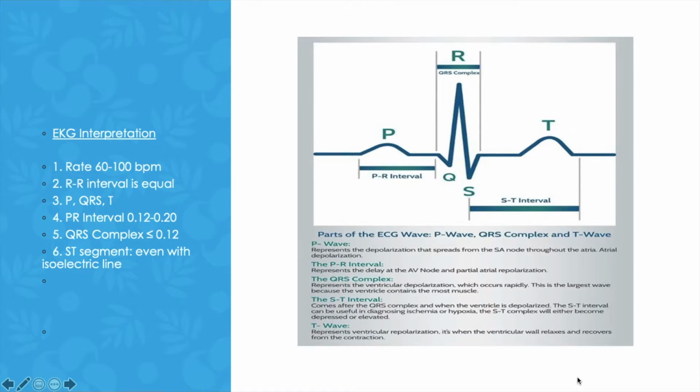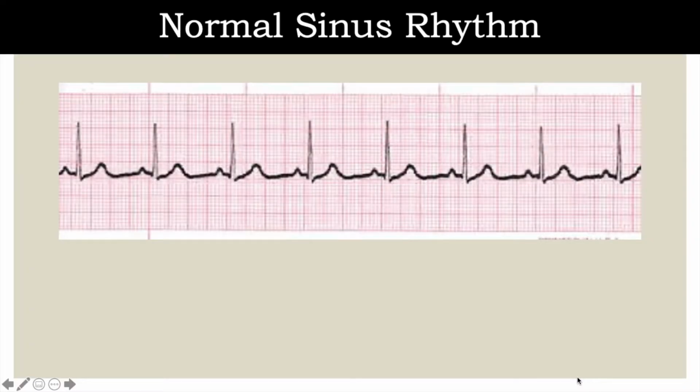And make sure that you remember that the EKG is telling you the electrical components of the heart. Don't get it confused with heart failure and muscle contractions and things like that. Think about electricity when it has to do with ECG, okay? E for electricity. So we're going to start off with your regular sinus rhythm.